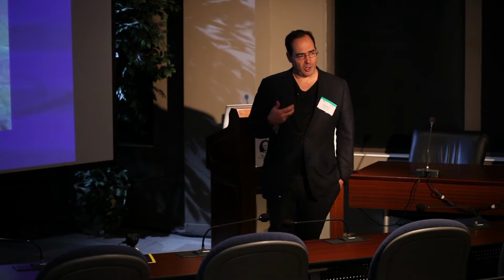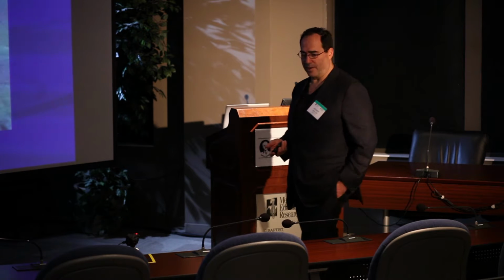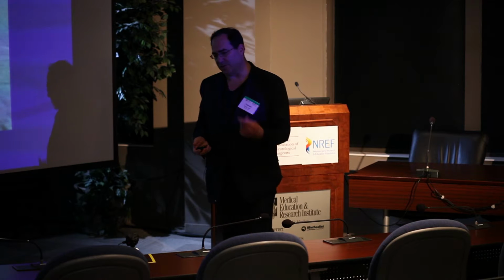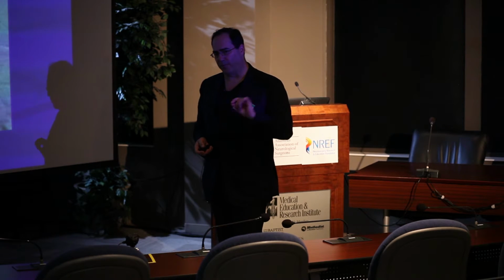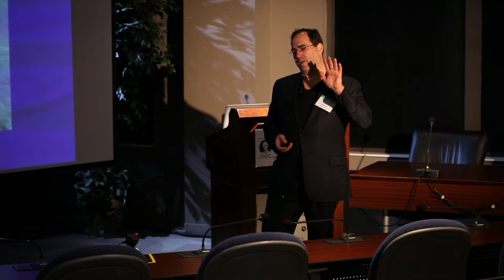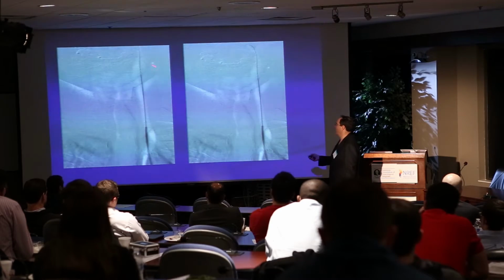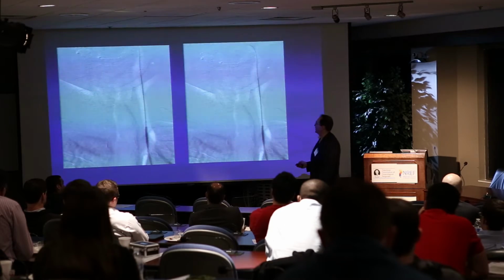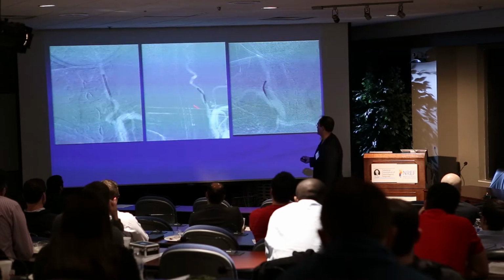So the general rule when you're learning is always slide over the wire, okay? My fellows will see me, and I watch them, and the residents, sometimes I'll watch them doing what I do, which is in young people just puffing and pushing the catheter up. Never force, let things go. Puffing and pushing at least will keep the tip off of the vessel wall. But the real safest way to do angiography is to go over a wire. And in the beginning, you should always do that. And then you slide, and like I said, you can have tortuous vessels, you can be straightening vessels.